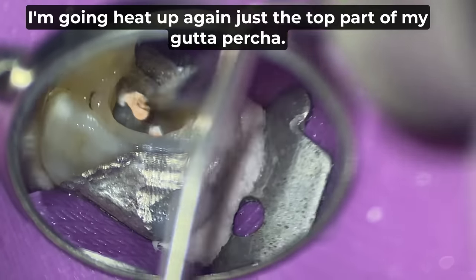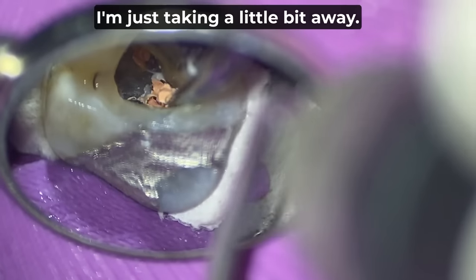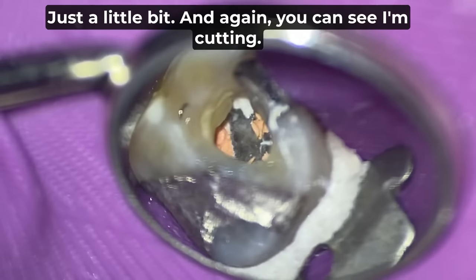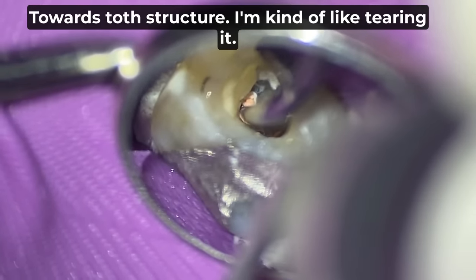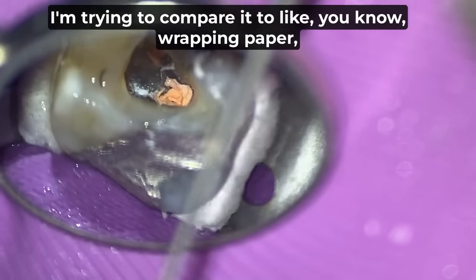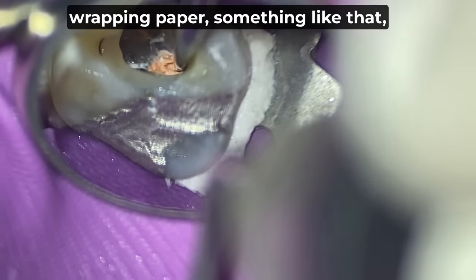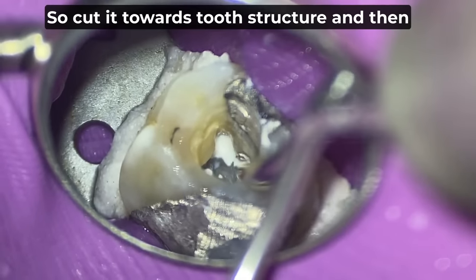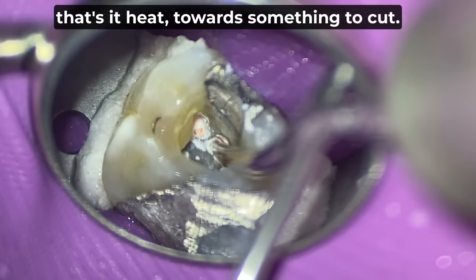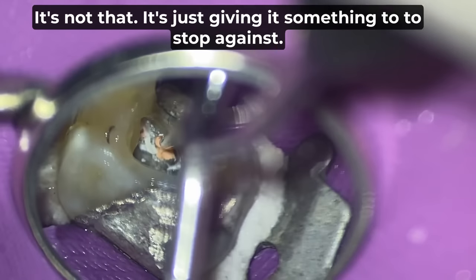Then I'm going to heat up again just the top part of my gutta percha. I'm just taking a little bit away. And again, you can see I'm cutting towards tooth structure. I'm kind of tearing it. I'm trying to compare it to wrapping paper, but it doesn't really compare that well. So cut it towards tooth structure, and that's it. Heat towards something to cut. My tip is not sharp, it's just giving it something to stop against.